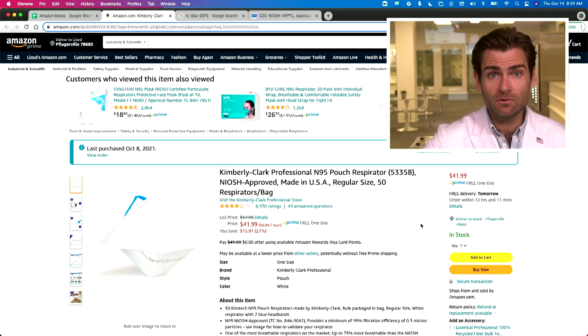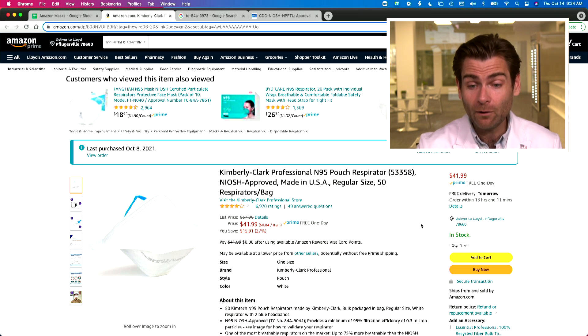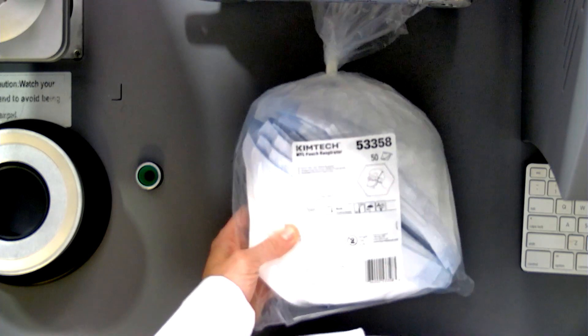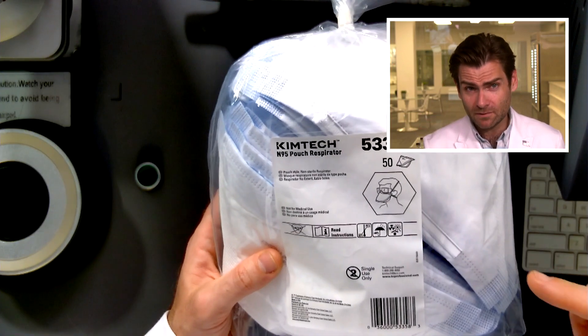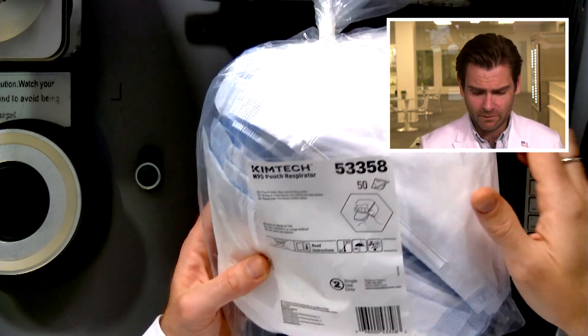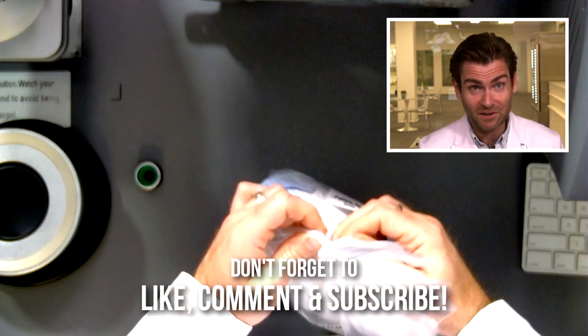Today we are looking at the Kimberly Clark Professional N95 pouch respirator, and it comes in a pouch. Do you think they were talking about the respirator or the bag? Seems weird to talk about the bag. All right, let's stop talking and put this in the clamper.